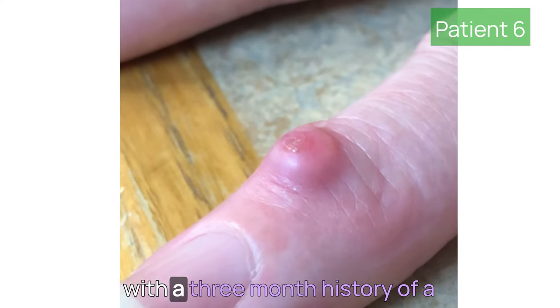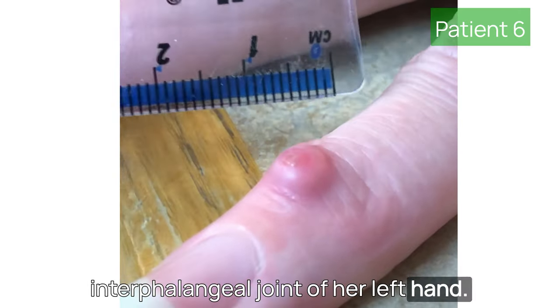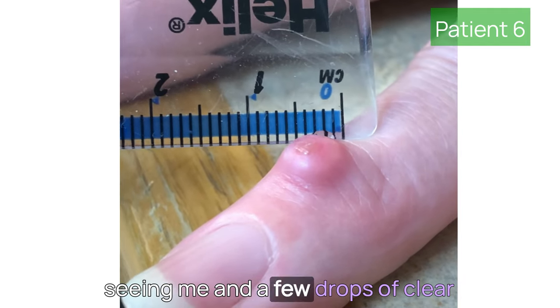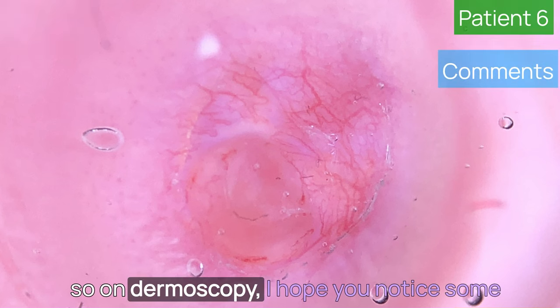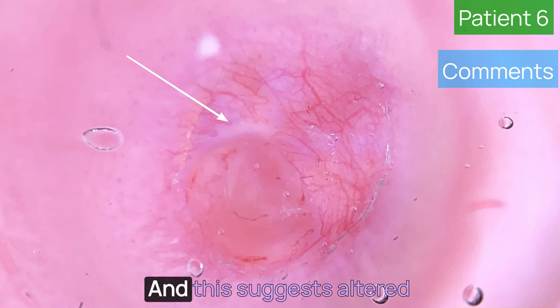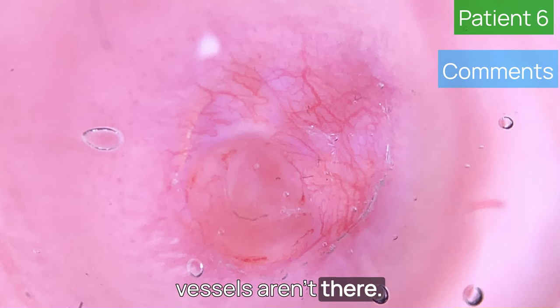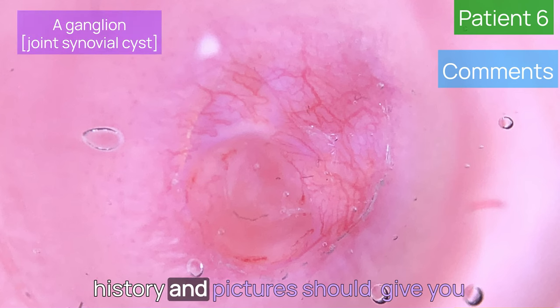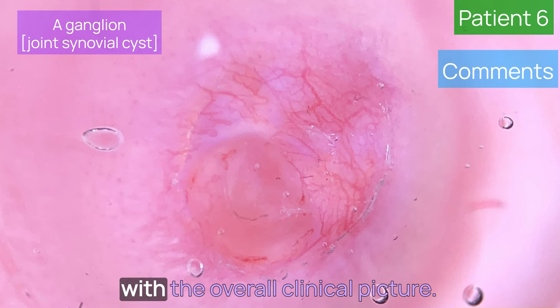This 37-year-old lady presented with a three-month history of a slowly growing nodule on her distal interphalangeal joint of her left hand. It had burst a few days prior to seeing me and a few drops of clear gel had come out of the centre. On dermoscopy, you'll notice some shiny white structures flashing on and off — this suggests older collagen, common in any scarring. But there are beautiful fine arborising vessels. This is a ganglion. The clinical history and pictures give you the answer, showing that dermoscopy must be read in conjunction with the overall clinical picture.